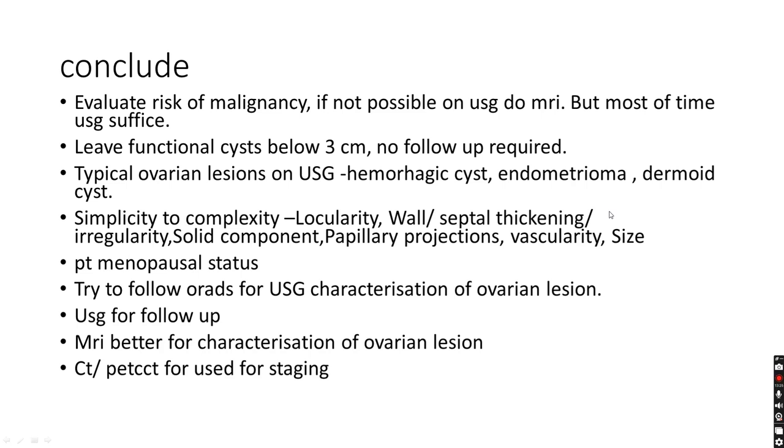Then in case of solid lesions, we have to consider shadowing, vascularity and irregular outer contour. So we should try to use it. It may feel very difficult initially, but we can keep the printout in the sonography room in a file, and we can try to use it.